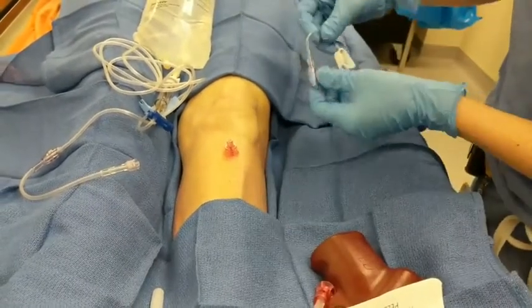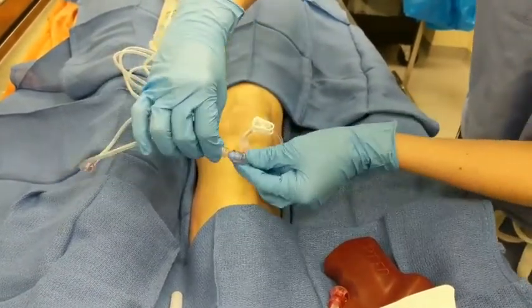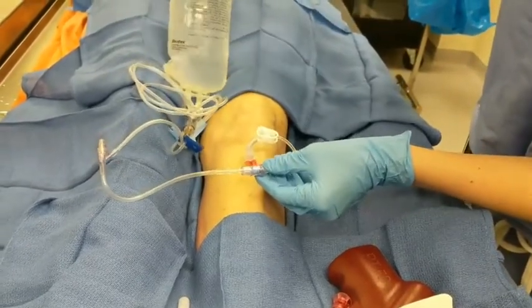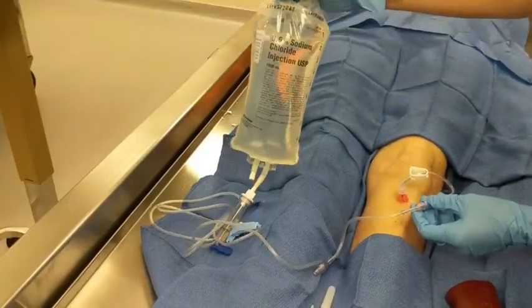After the intraosseous line is in place, the needle should be protected and the line connected to intraosseous tubing and then connected to IV fluids. Confirmation of placement is found when IV fluids are found to drip freely.